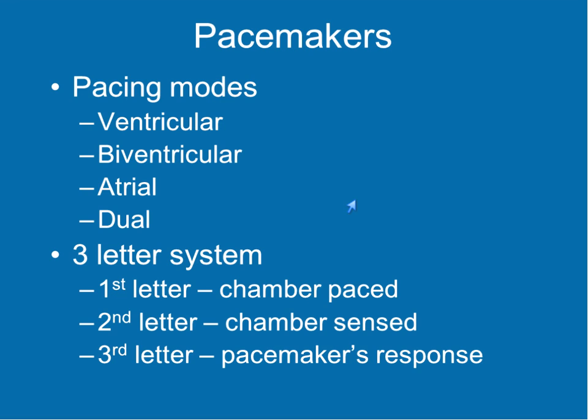Okay, so the pacemaker was working in that it sensed what the heart was doing and chose to do nothing. Okay, good job, pacemaker. Here's another example. The pacemaker in the atria is sensing what's going on, and it does not sense any activity. It waits a certain amount of time. It's all preset. Still no activity. It fires in the atria to depolarize the atria.